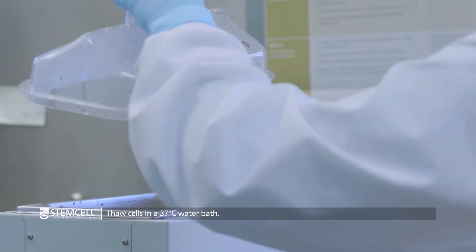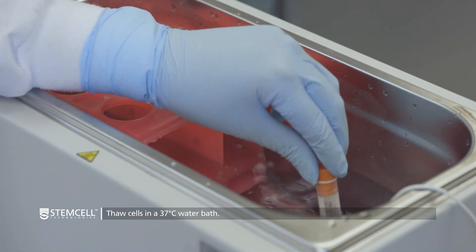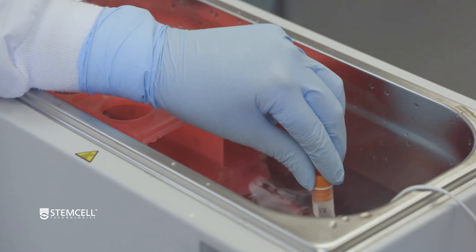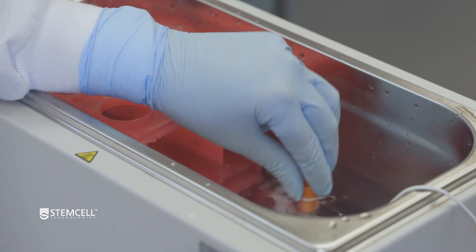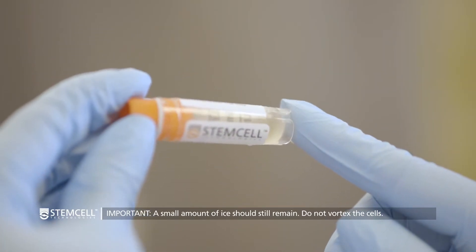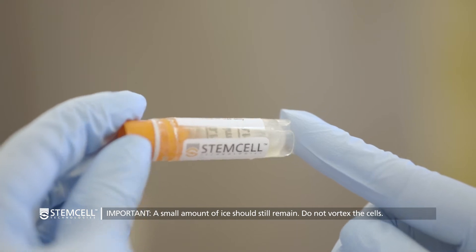Quickly thaw the cells in a 37 degrees Celsius water bath by gently swirling the vial. Remove the vial when it is almost completely thawed — there should be a small amount of ice remaining. This should take approximately one to two minutes. Do not vortex the cells.